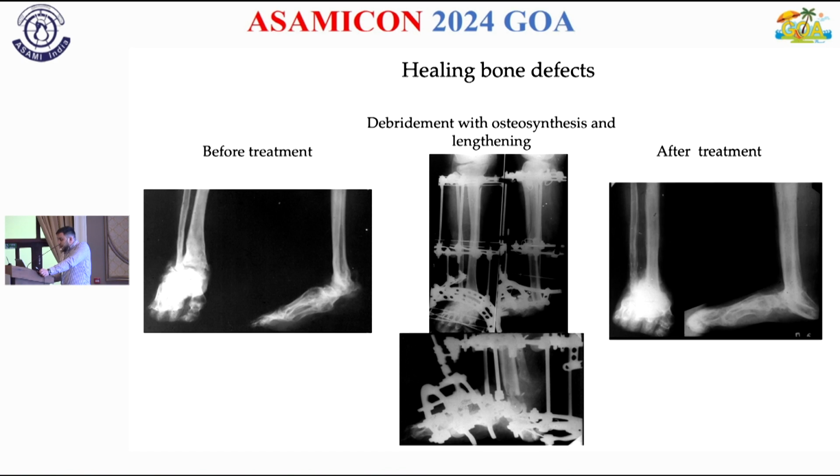Another interesting possibility is healing of bone defects. In that case, a 32-year-old patient, after traumatic injury of the hindfoot, was admitted to our department with total hindfoot bone defect. For healing that bone defect, after sequestral necrectomy, an Elizarov fixator was applied and an osteotomy was made on the proximal side of the tibia, and then bone transport into the hindfoot bone position was started.